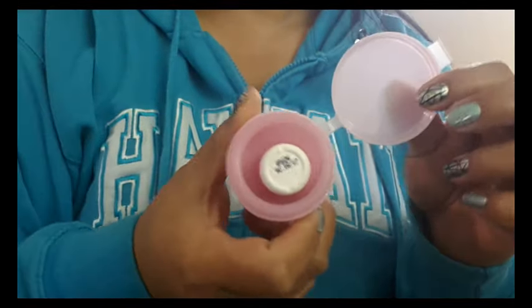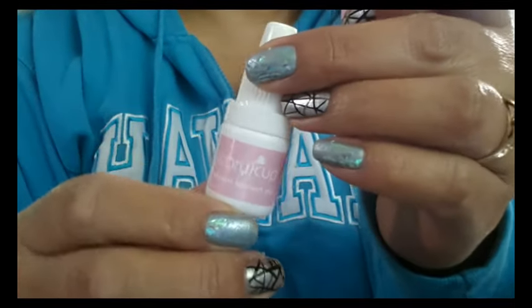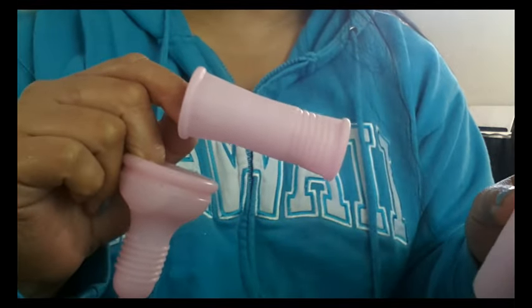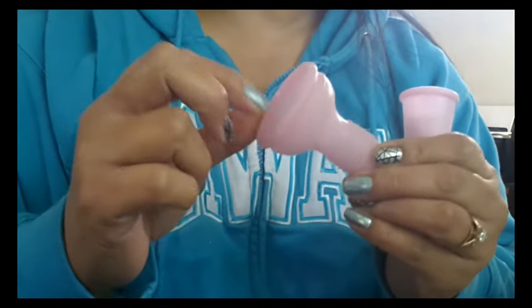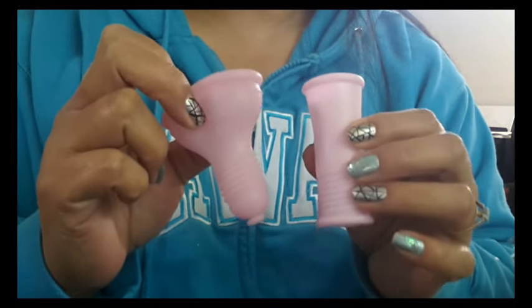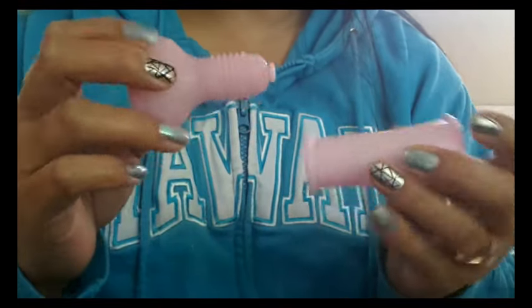This is how the container looks when you open it. You do get a little bottle of lube, and it does have that 'Lubri Cup' name on it. Then you get the cup itself and an applicator. According to the website and the paper, this cup is made out of silicone and TPE. Both the applicator and the cup are made of these two materials, and I've never heard of a cup being mixed like that — I'm not quite sure how they do that.